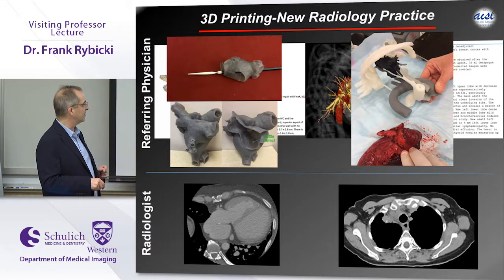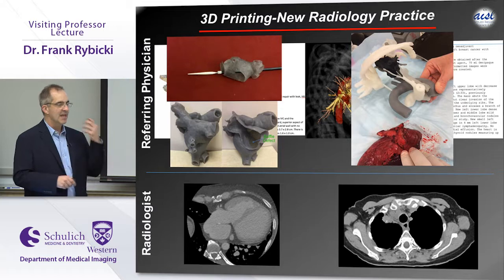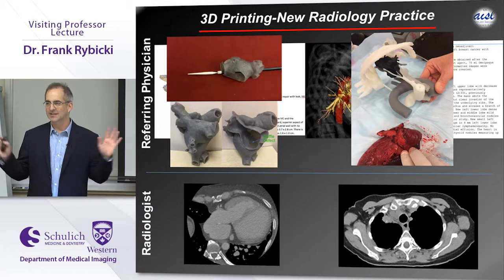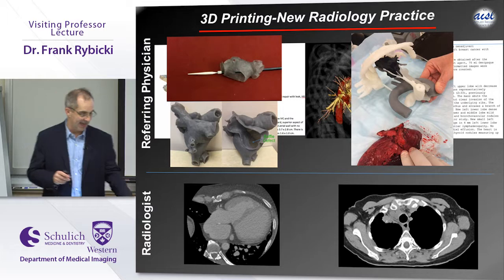This was considered to be unresectable. As soon as we gave them the model, with the tumor in black, where you can see the aorta and the ribs, they went after the case and said they can do it. It's invariably the second that the surgeon gets the thing in their hand, they say, okay, now I understand the case, and they'll never look at the images again. It's just a matter of how that's actually going to happen, right?